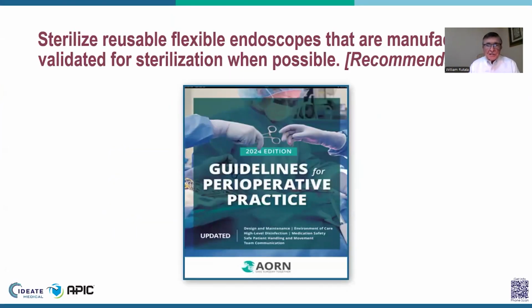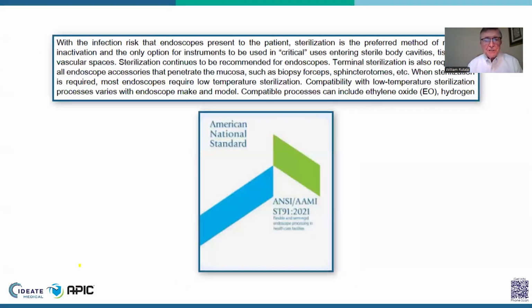In the next slide, essentially, we're going to look at some of the recommendations from professional organizations regarding this issue of high-level disinfection versus sterilization. We know from AORN that they recommend sterilizing reusable flexible endoscopes that are manufacturer validated for sterilization when possible. In the next slide, we see essentially a recommendation from AAMI. And what AAMI says is sterilization continues to be recommended for endoscopes. And they talk about the infection risk, and the only way you can eliminate that infection risk is essentially sterilization of these critical items.